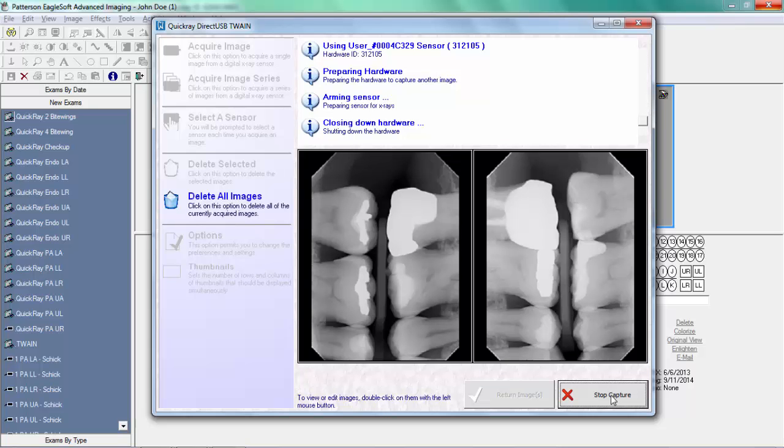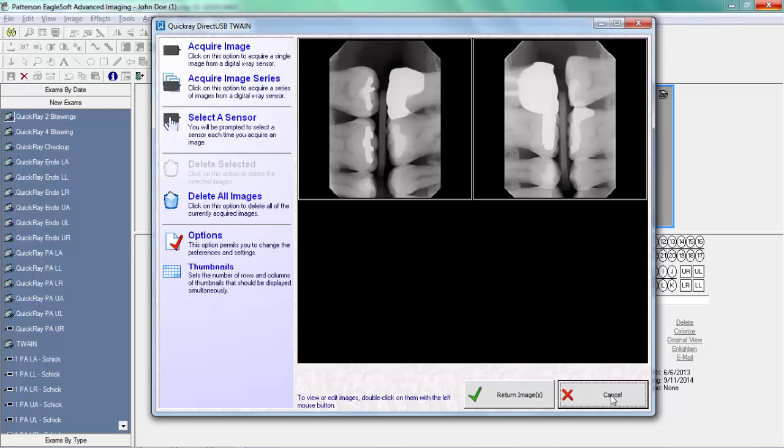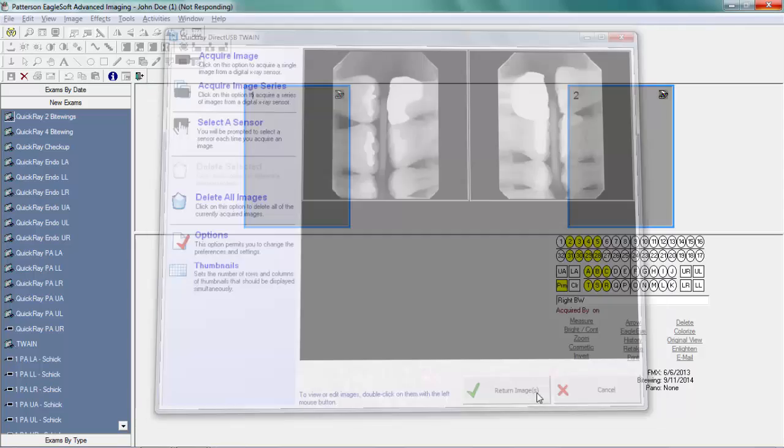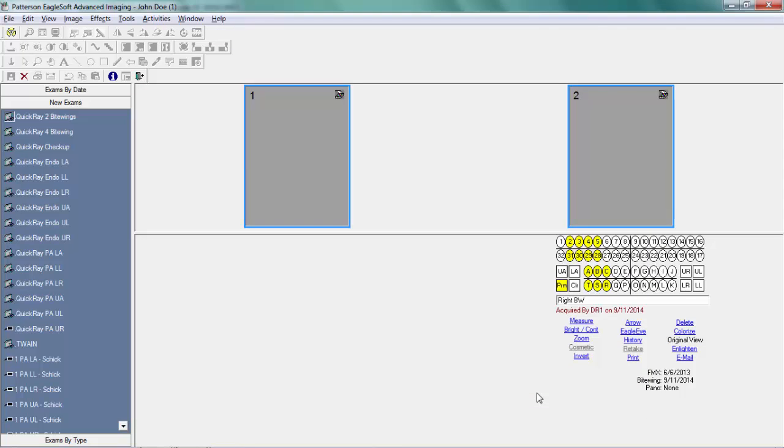The images are then returned to EagleSoft, where they are saved on the patient record in the EagleSoft database.